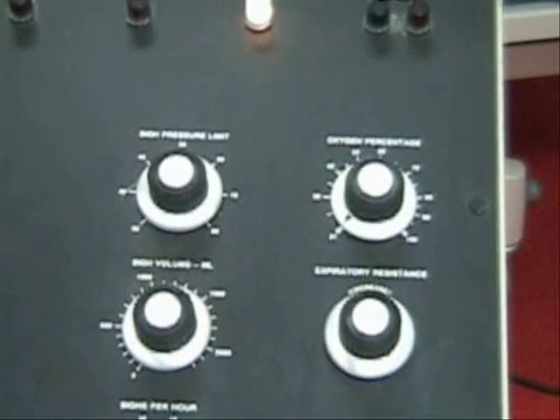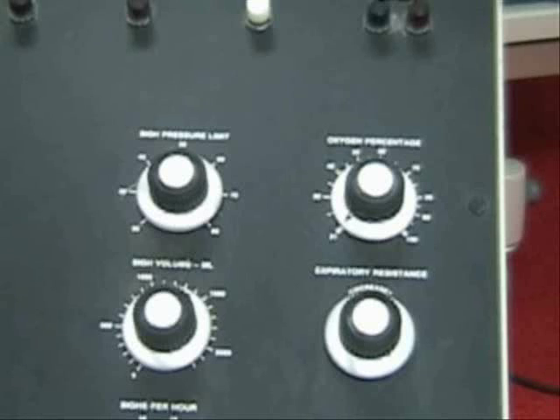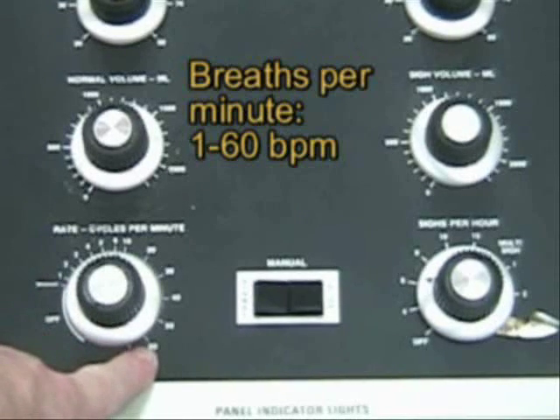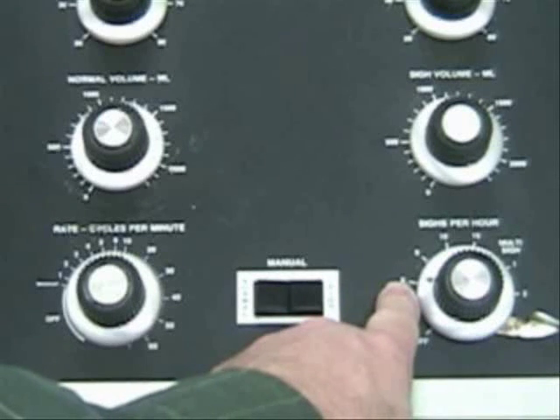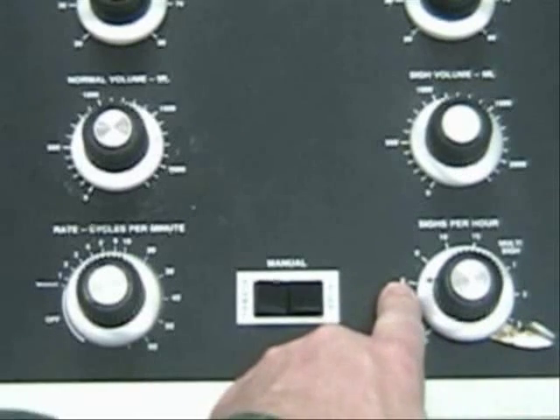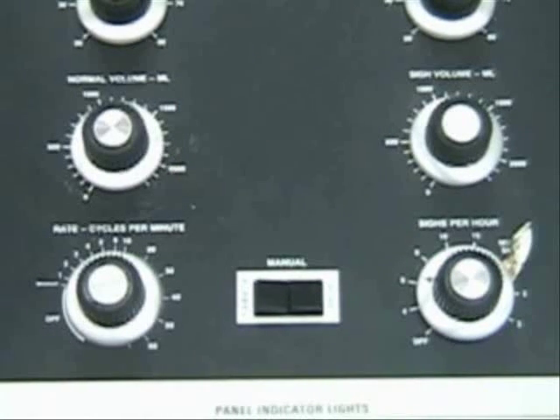We have our oxygen percentage setting, which shows us whenever we're not delivering sufficient oxygen pressure — it doesn't actually measure the FiO₂. Below we have our rate in breaths per minute, which goes all the way from one up to 60 breaths per minute. You simply dial it in and then count the actual rate and adjust if the knob is slightly off. Over on this side you can see the sigh breath settings: how many breaths per hour and how many deliveries each time. Here we have it set at three breaths, six times an hour — so about every 10 minutes.